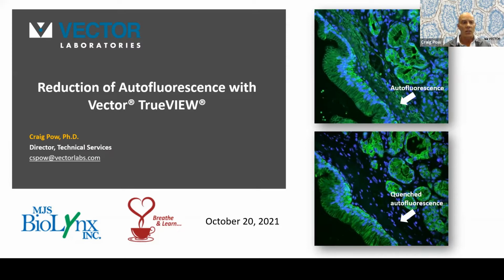Or indeed, it might be a little more subtle, such as the example I've got here on this particular image. For example, the green here is highlighting cytokeratin with a specific antibody. If indeed you're working on, say, a treated specimen or something that might be a disease state, you might think, wow, look at this cytokeratin infiltration into this dermal area, when in fact it's actually autofluorescence. This is an example of that autofluorescence that's now been quenched. So indeed, the more subtle autofluorescence could be interpreted as specific staining, be reported, and that would be a false result. So certainly this is problematic for many investigators.